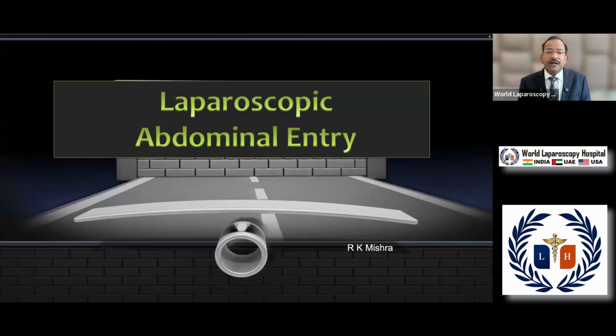So, today we are going to discuss the laparoscopic abdominal entry that is called access technique. Access is the key of success. In minimal access surgery, the technique of entering into the abdominal cavity with the telescope is called access technique.